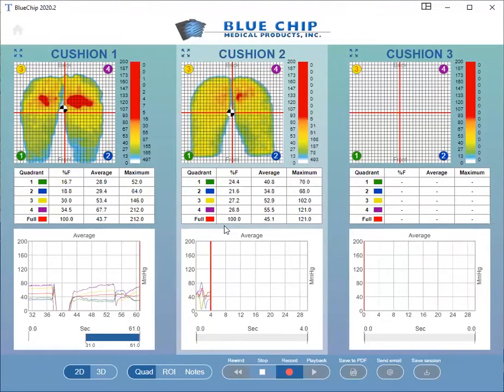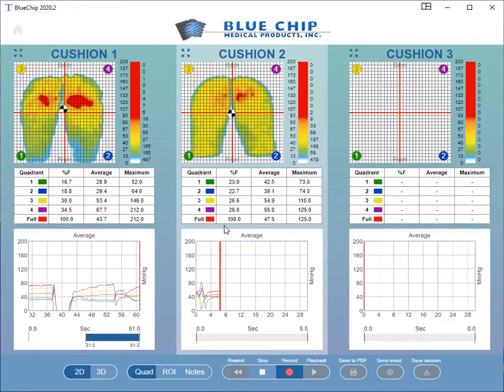Click Stop when done. Repeat these steps for the second and third cushions.